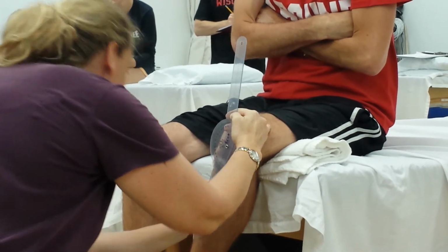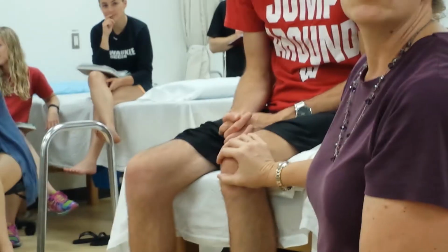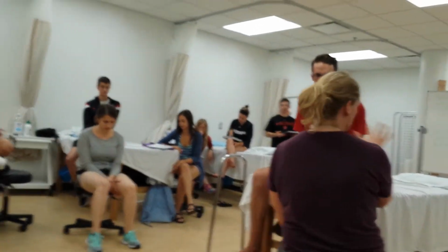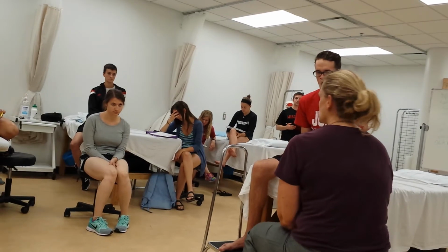And there you're at 0 to 25. So that's good. That's more restricted. Okay, so that's how you're going to measure medial and lateral rotation. Okay, so you're going to do it in sitting, and actually, like I said, you're going to do manual muscle testing in this position as well. So usually you would just do all 4 of those tests right away.